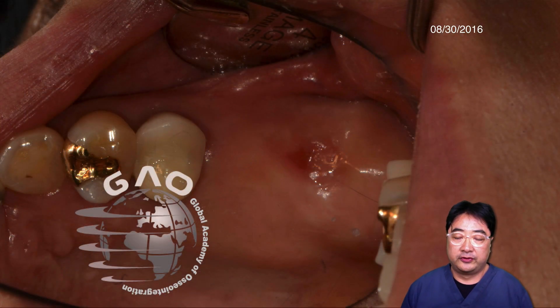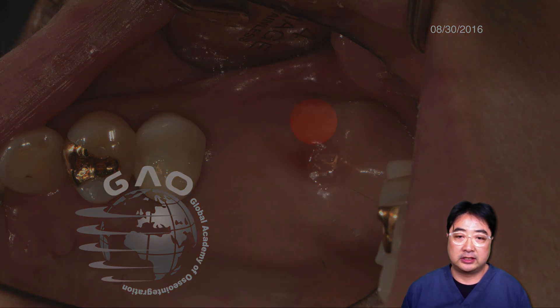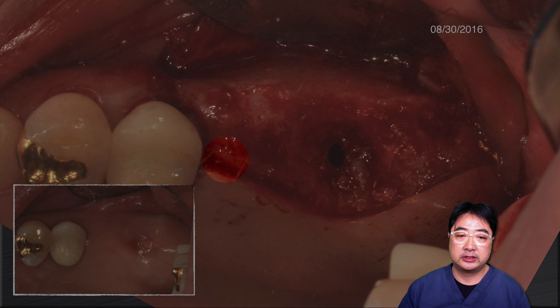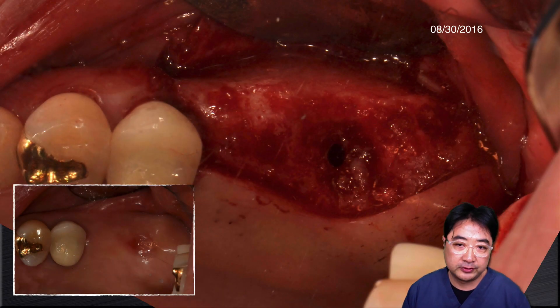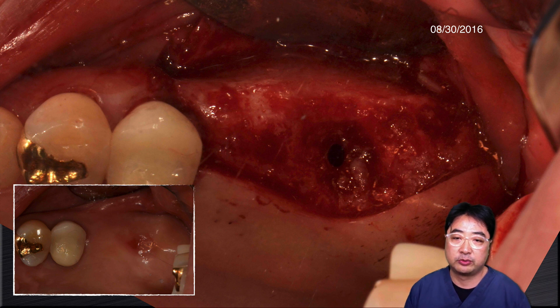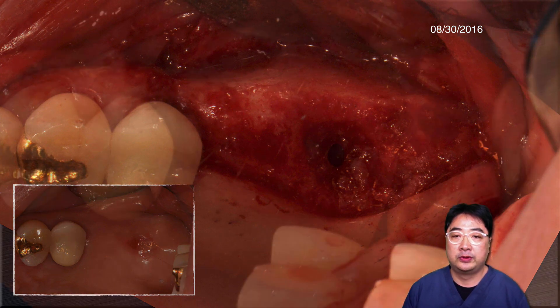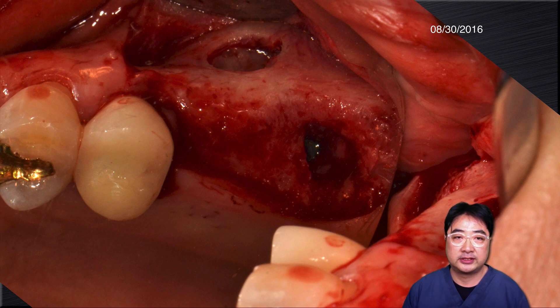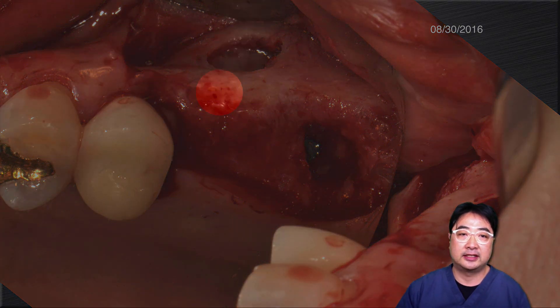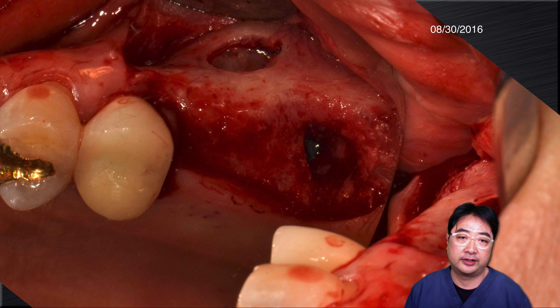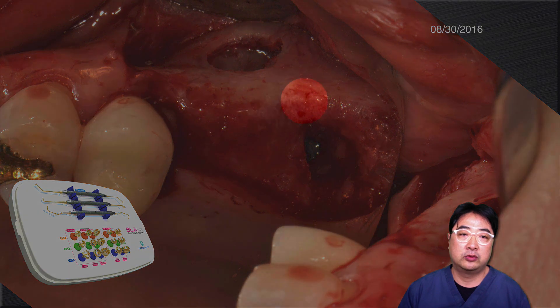This is the initial picture on the day of the sinus graft. You can see the redness on the number 27 area. I made an incision, moving it toward the palatal to expose this area, and I did very careful dissection, but I couldn't prevent the perforation on number 27 area, which was already visible as open in the CT scan. After I found the perforation, I made a window on the anterolateral wall of the left maxilla and dissected the sinus membrane until I could see free movement of the perforated area.